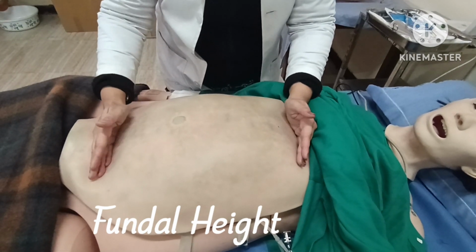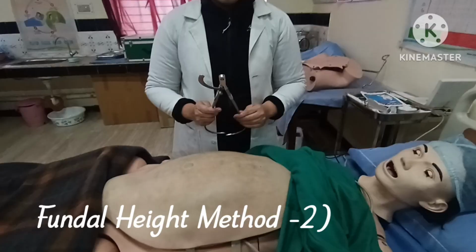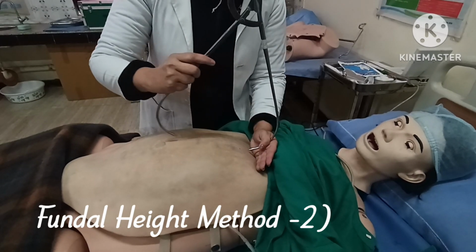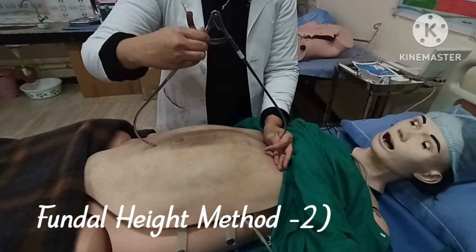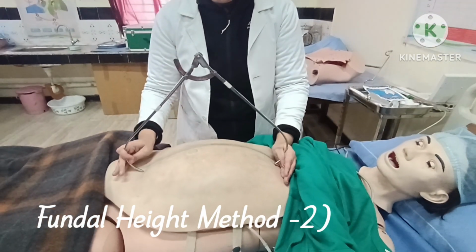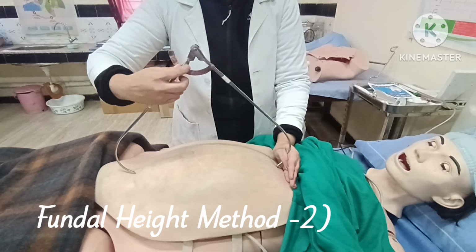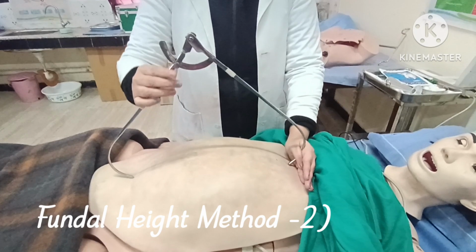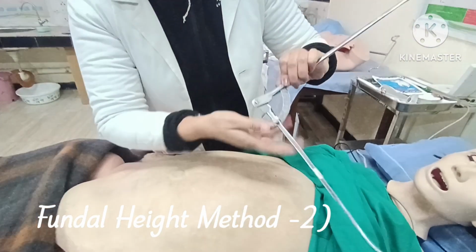Second method, by using pelvimeter, also called caliper method. Place one tip of the caliper at the top of the fundus and the other tip on the superior border of the symphysis pubis. Read the measurement on the centimeter scale located on the arch close to the joint. The number of centimeters should be equal.